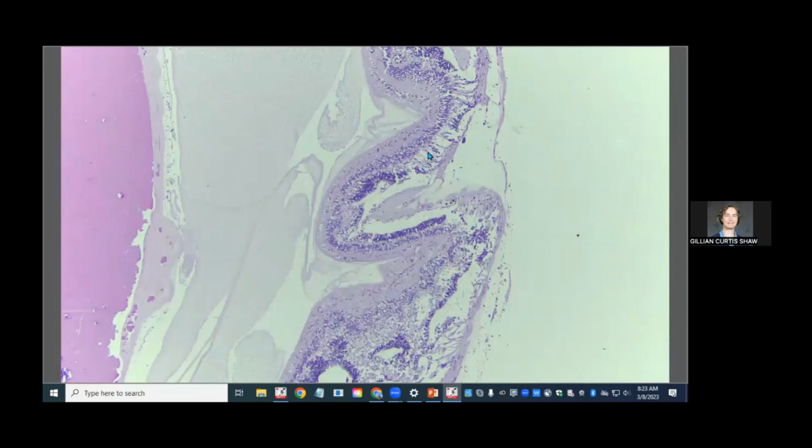So in this case, I don't know which came first. Let's see, did we diagnose? Yeah, the vitreous was liquefied in this globe. So once again, there could have been a secondary retinal detachment associated with vitreal degeneration. I didn't find very many ganglion cells, but you can see some of them here and there.